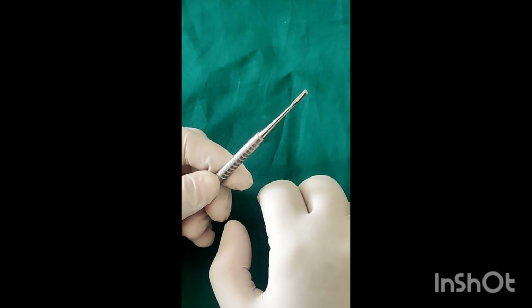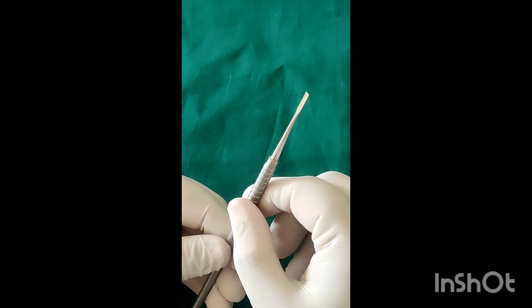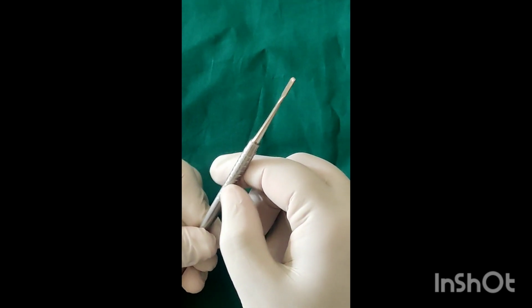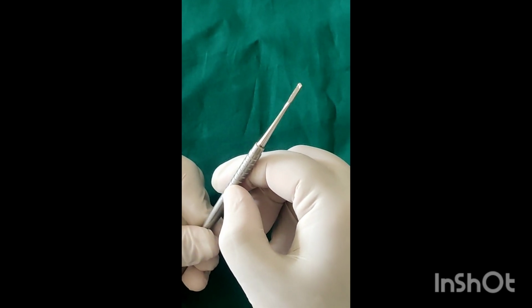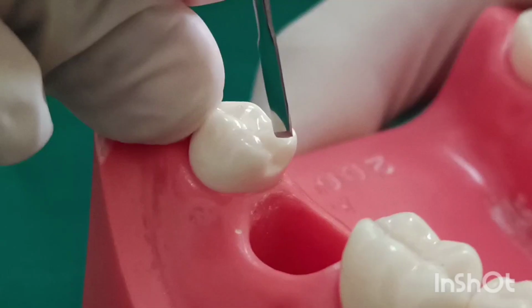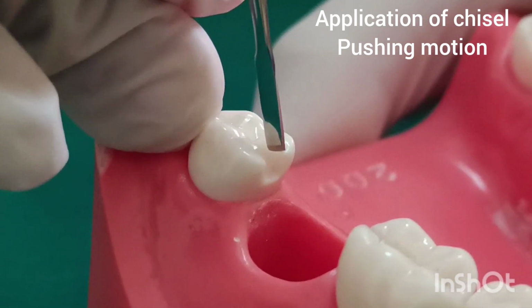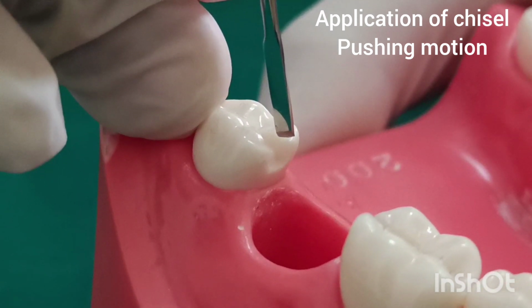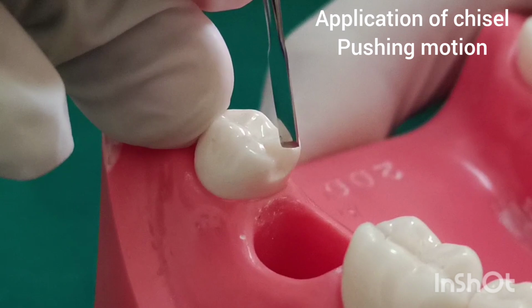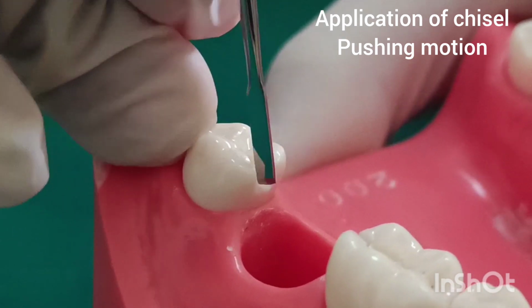There is no need for a right and left type in a straight chisel because a 180-degree turn of the instrument allows for its use on either side of the preparation. Hold the cutting edge of the chisel against the wall and use a pushing motion to plane the wall.